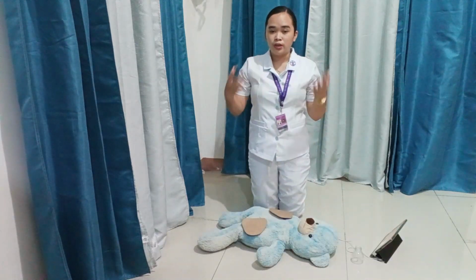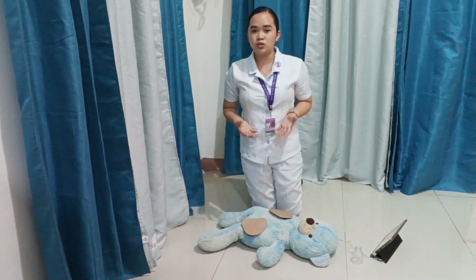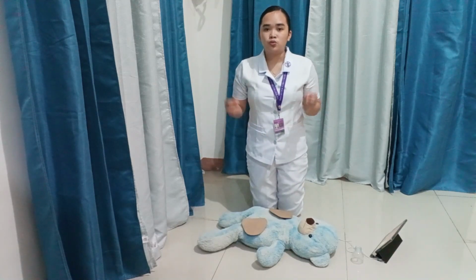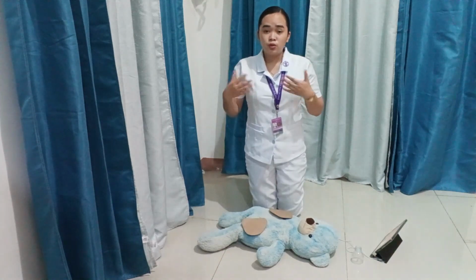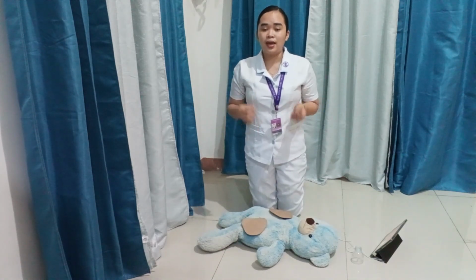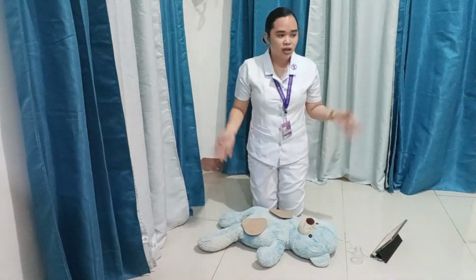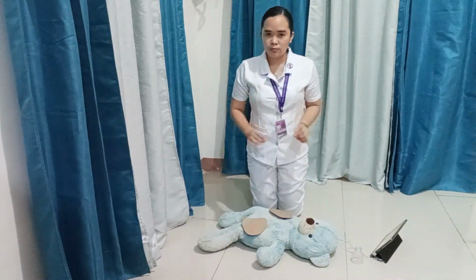So now we need to clear for analysis, because for evaluation of the heart rhythm, we need to stand by and prepare to shock. We need to always remember that we don't touch the patient and let the AED analyze. Everyone, move away from the patient and do not touch the patient, including me.